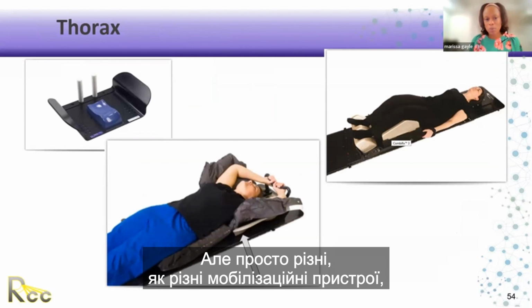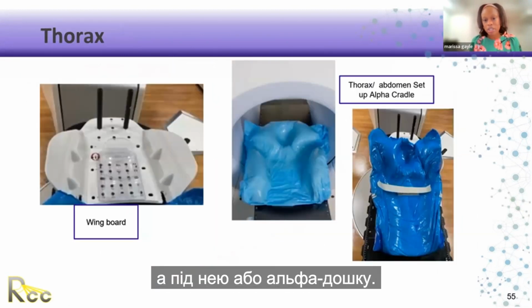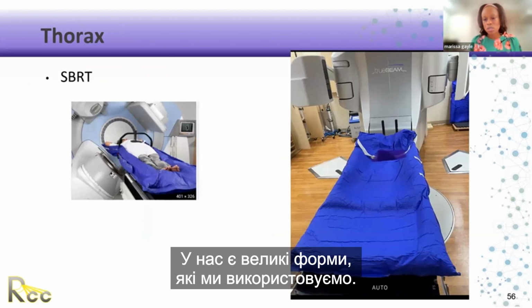But just different immobilization devices that we have. If you want to treat the thorax, some ideas: you can use a wing board and a Vac-Lok or Alpha Cradle underneath. This is with the Alpha Cradle and the wing board. This is if you want to do a large SBRT. We have these large molds that we use.